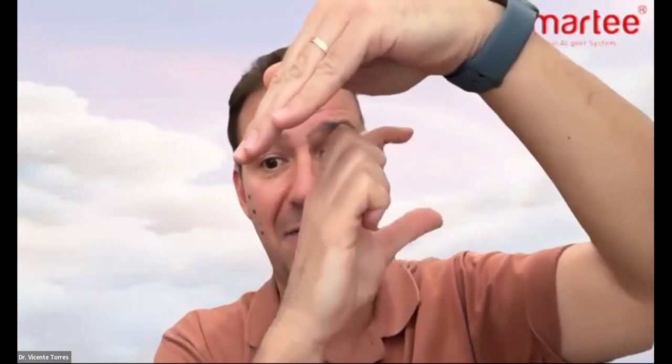Yes, exactly, doctor. This is the question I explained in the webinar. Of course, if we need 5 millimeters in the posterior area, sometimes if we finish edge to edge contact, we don't have enough space. So sometimes we need to have an open bite, a full open bite, posterior and anterior. But the most important thing is the 5 millimeters in the posterior area. So if I need to achieve this 5 millimeters in the posterior area, and I need to finish the wax setup with a little open bite in the anterior area, it is mandatory. This is the important thing: always we need 5 millimeters in the posterior area.